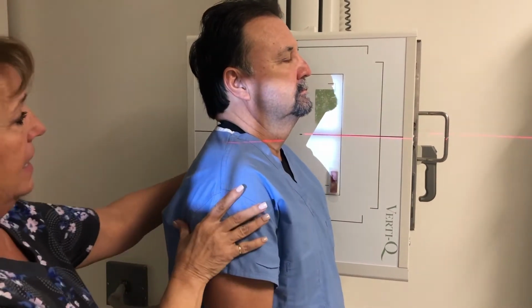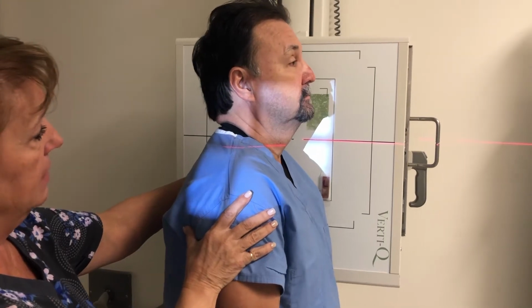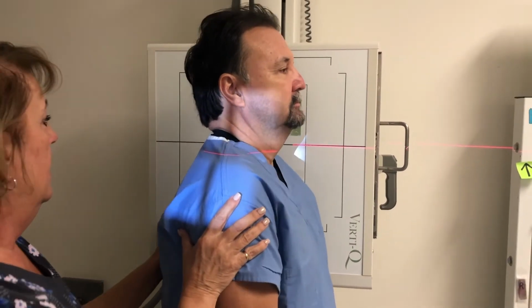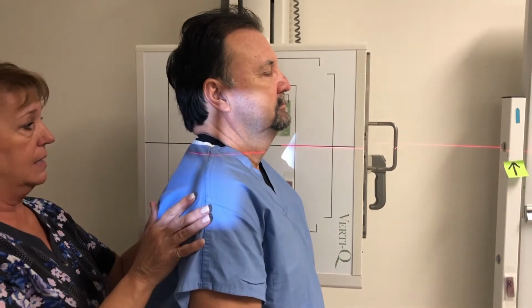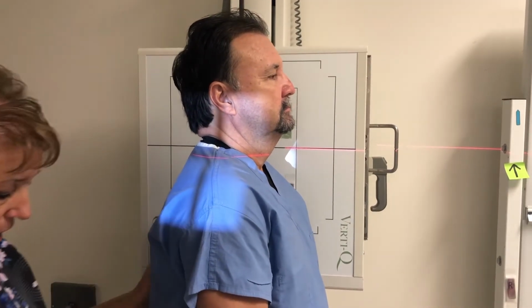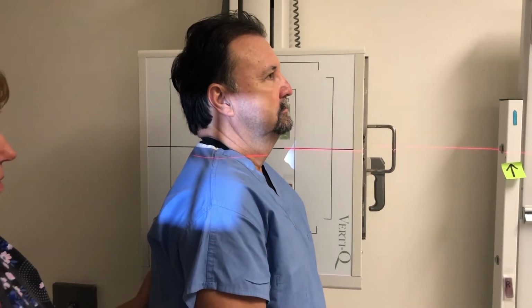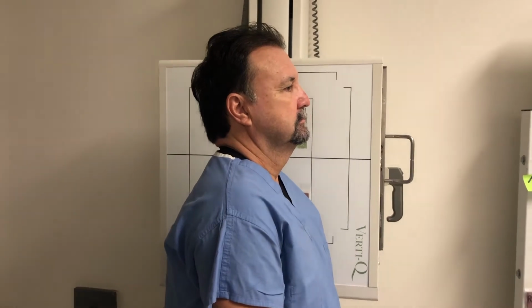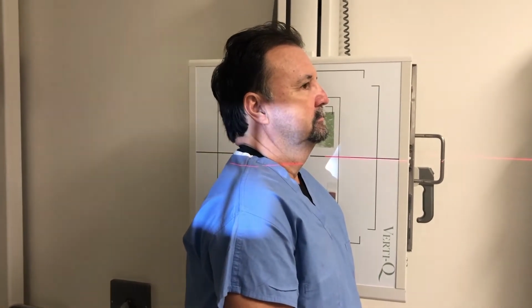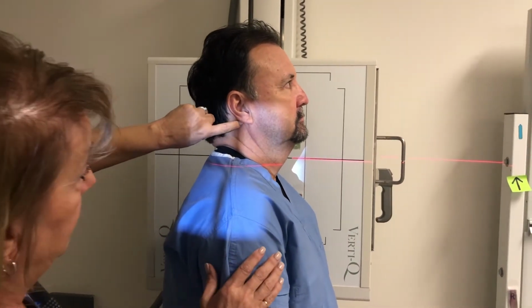Okay, and I want to be on his mid-coronal plane, so take just a small step forward. You want to make sure that his left or right side is up against the wall bucky. His feet are spread apart a little bit for balance, and where his mastoid tip is roughly is his mid-coronal plane.